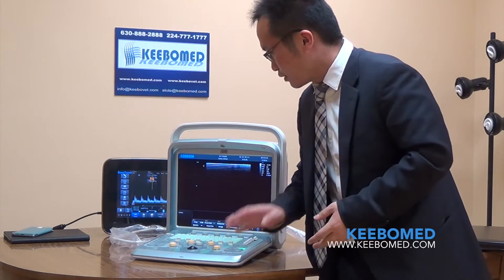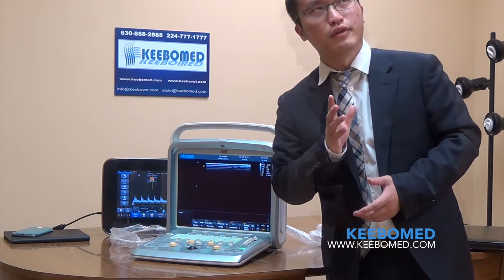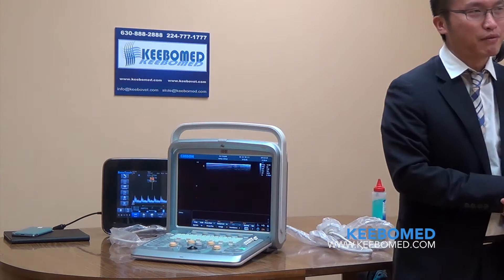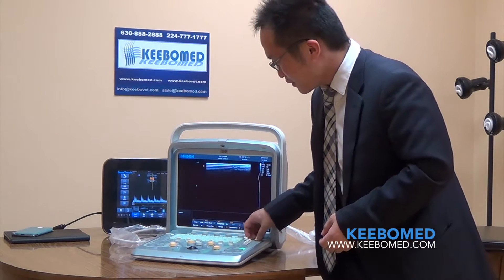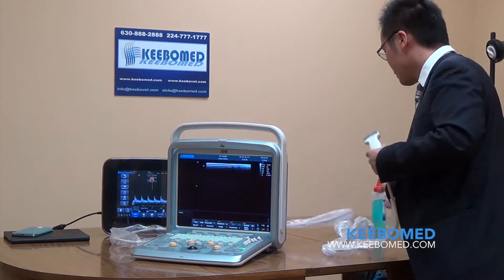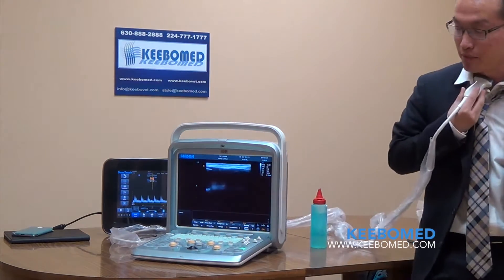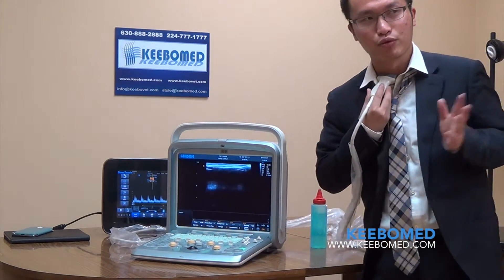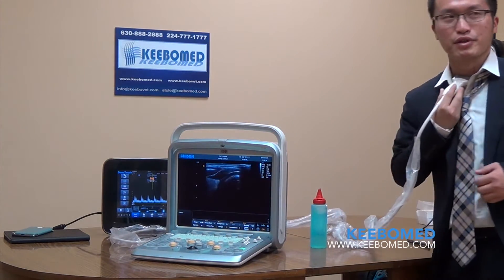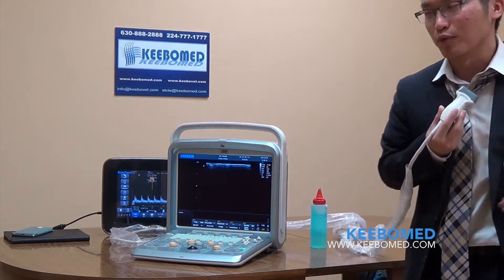We also have a function — on the Q5 we call it one key, or AIO. AIO means Automatic Image Optimization. Sometimes the image looks strange and if you don't know how to adjust it, just press one key and you get a good image. That is what AIO means.